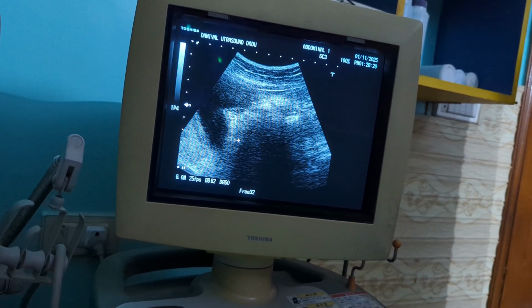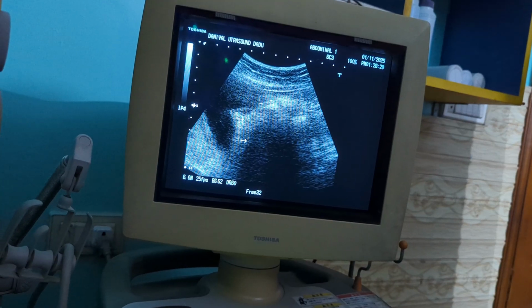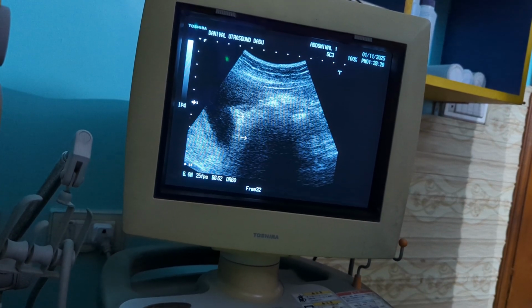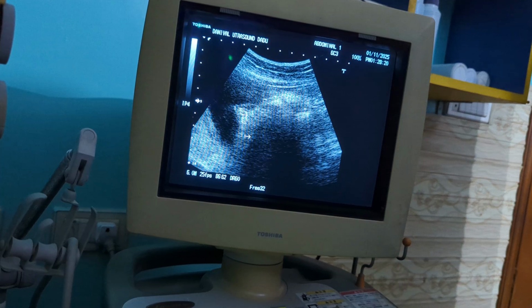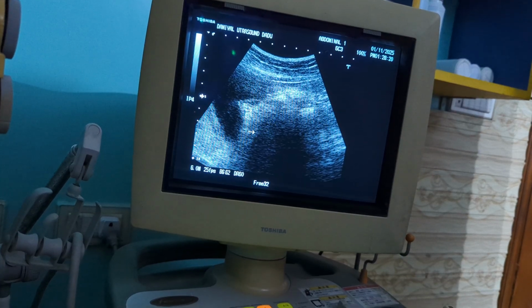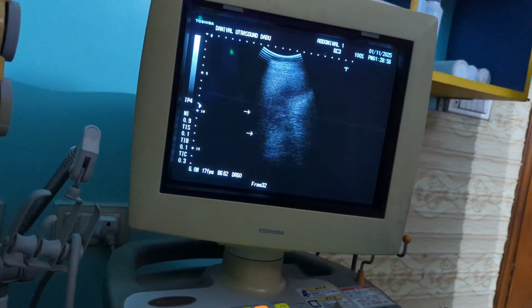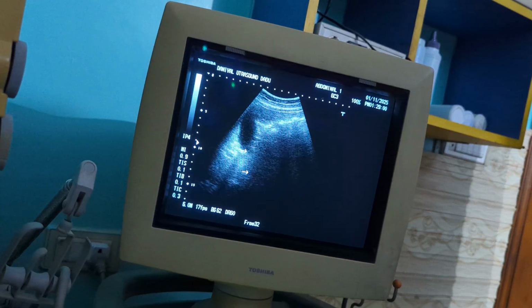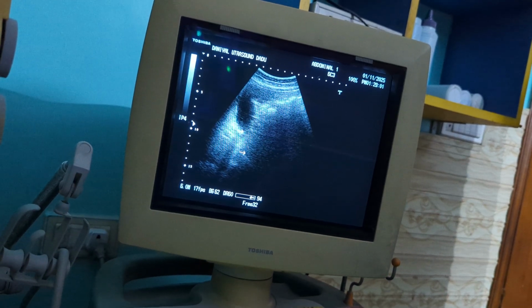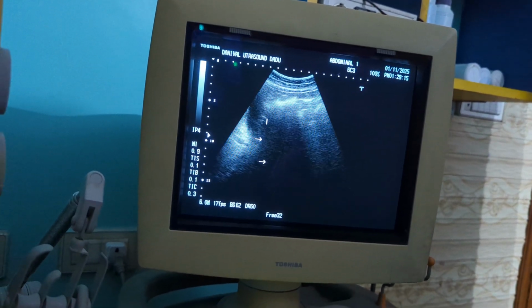So now to summarize, once again I repeat that the gallbladder is moderately distended with two mobile free gallstones. One of them has been lodged in the neck or cystic area causing obstruction, and there are signs of inflammation as well. The impression would be ultrasound features consistent with an obstructed gallbladder due to an impacted calculus at the neck region. So we can again go to the neck and see here the gallbladder stone, which measures approximately 1.1 centimeters.